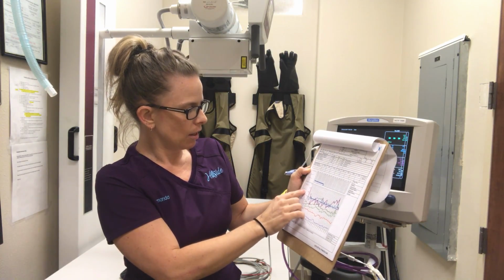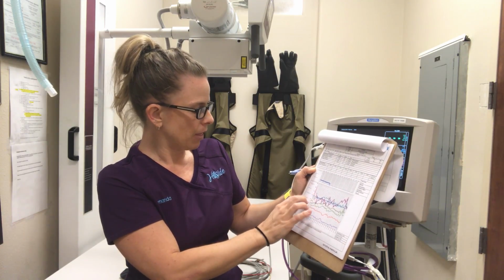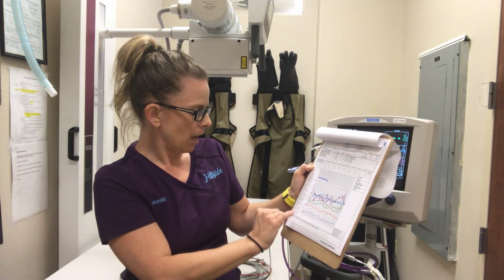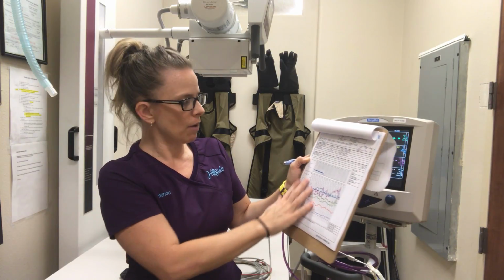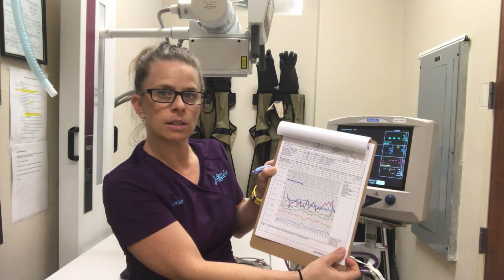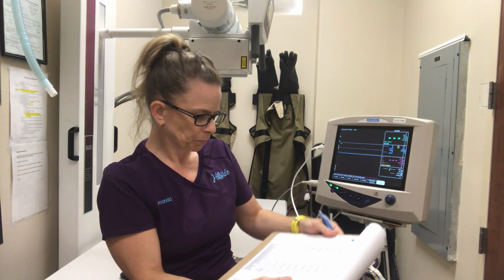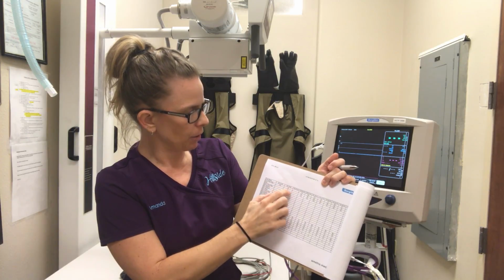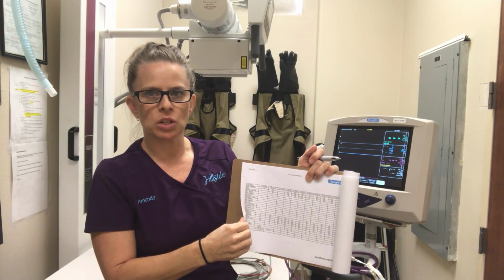The ECG, the SpO2, the oxygen saturation, the blood pressure, systolic, diastolic, and mean, the end-tidal CO2, and then the respiratory rate. So everything is really nicely put here in one chart. And then I've got little breakdowns of each. So this is breaking it down and recording it every 5 minutes, so we know exactly how that patient is doing.